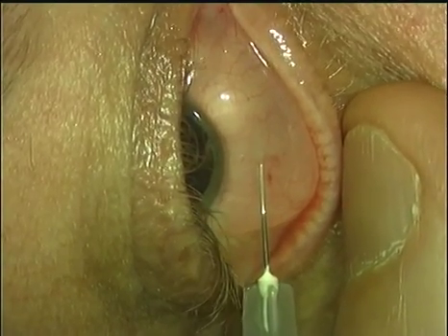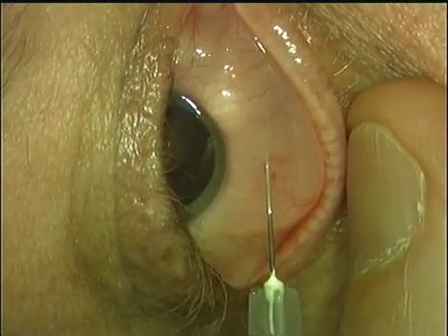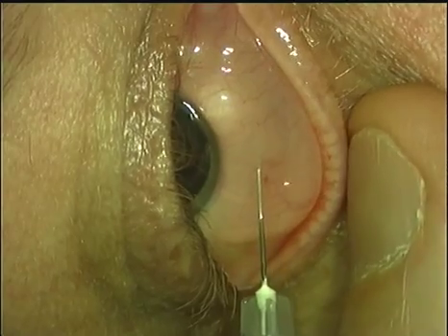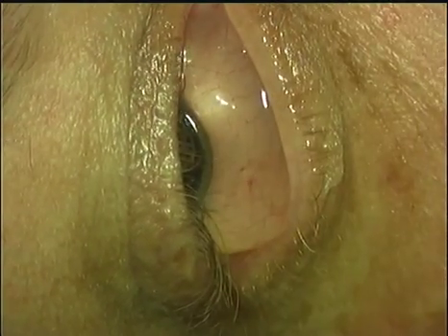This is real time. The injection has to be given gently and slowly, and whilst the patient feels nothing it is important to maintain reassuring vocal local.